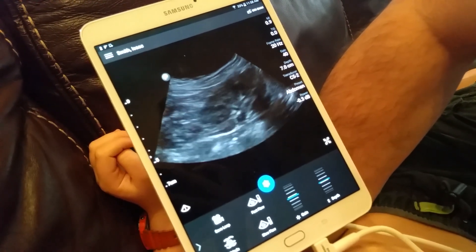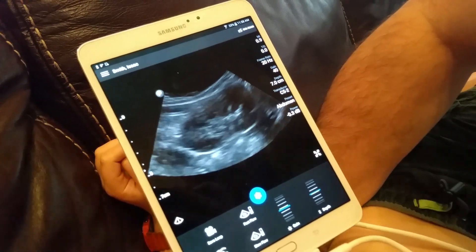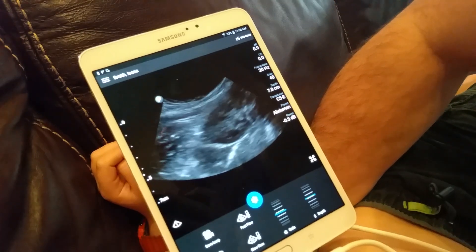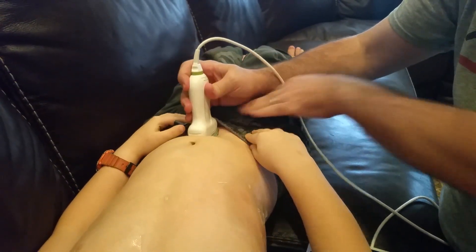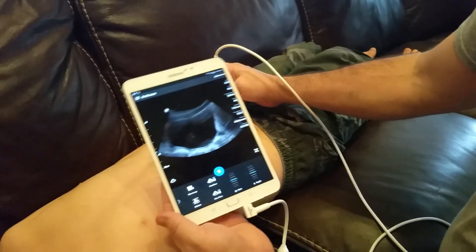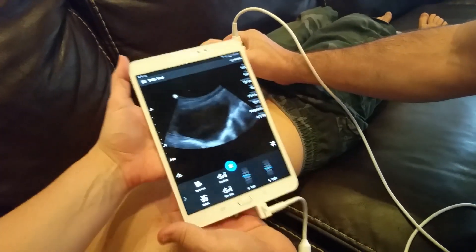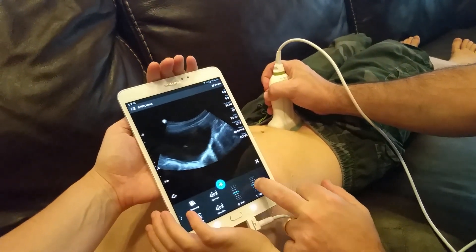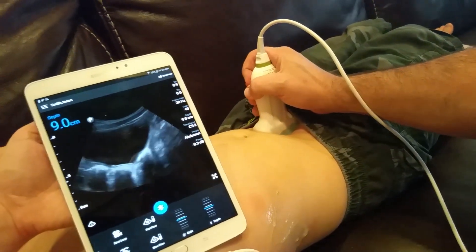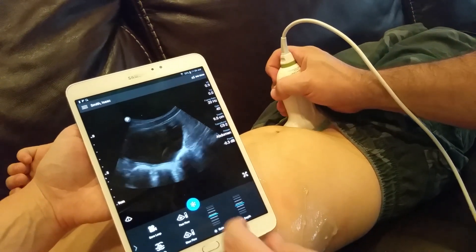You can see the kidneys are not too small and the pyramids are a reasonable size. Last but not least, have the patient lay flat on their back to assess the urinary bladder — is there urine in it or not? Rest the bottom of the probe right on the pubic symphysis, and that big black area you see is the urinary bladder. Behind that is bone causing reflection.